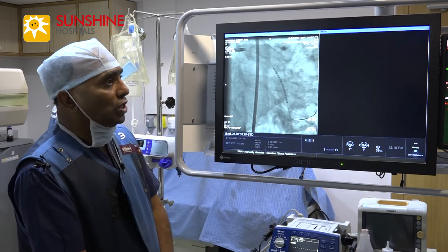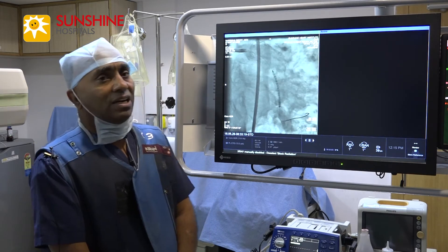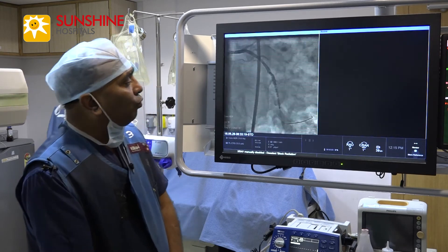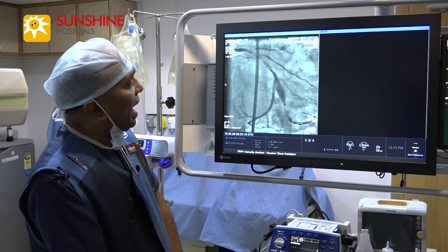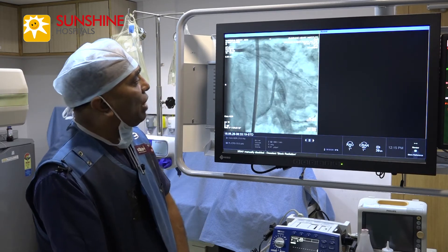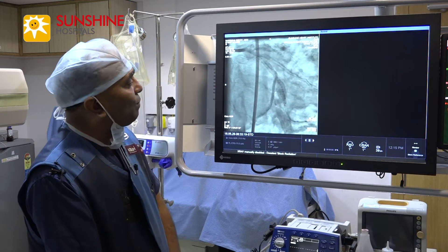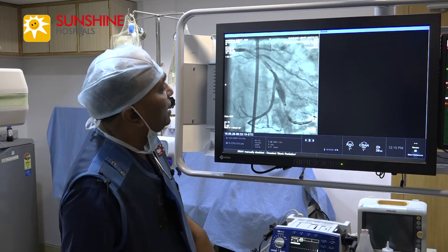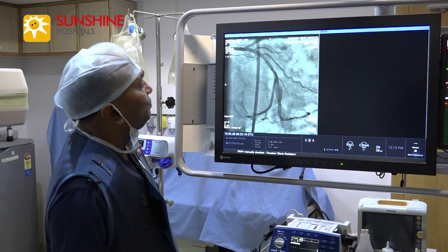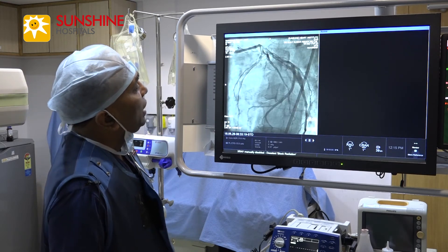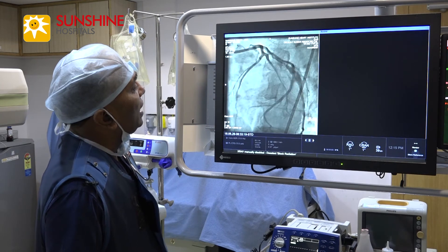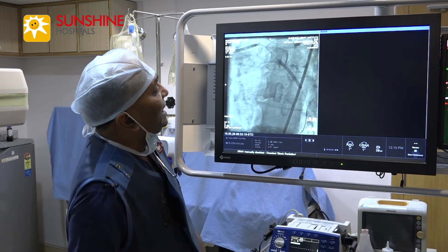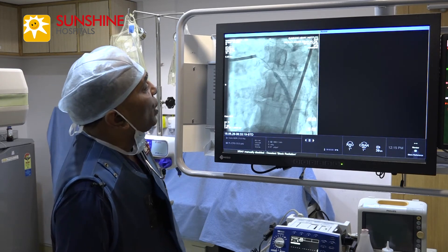For that, we have chosen to put a covered stent called a Graft Master. We passed the wire and selected a 3.5 by 26 Graft Master covered stent. This is the exact position of the covered stent. We have checked the exact location of the aneurysm and inflated the Graft Master stent to 15 atmospheres.